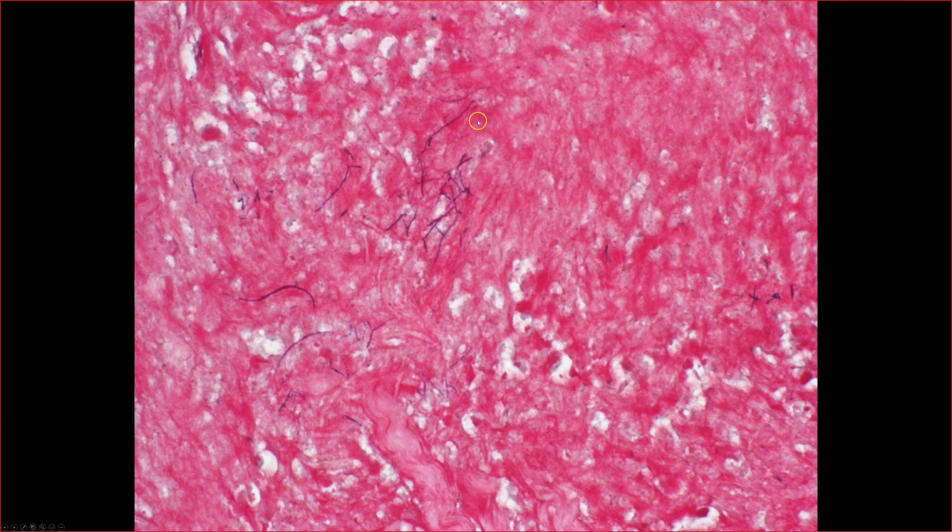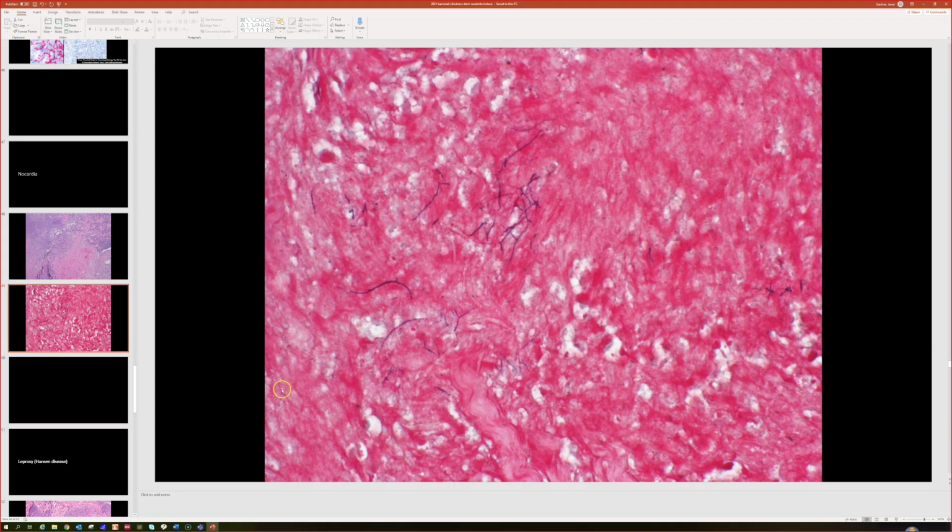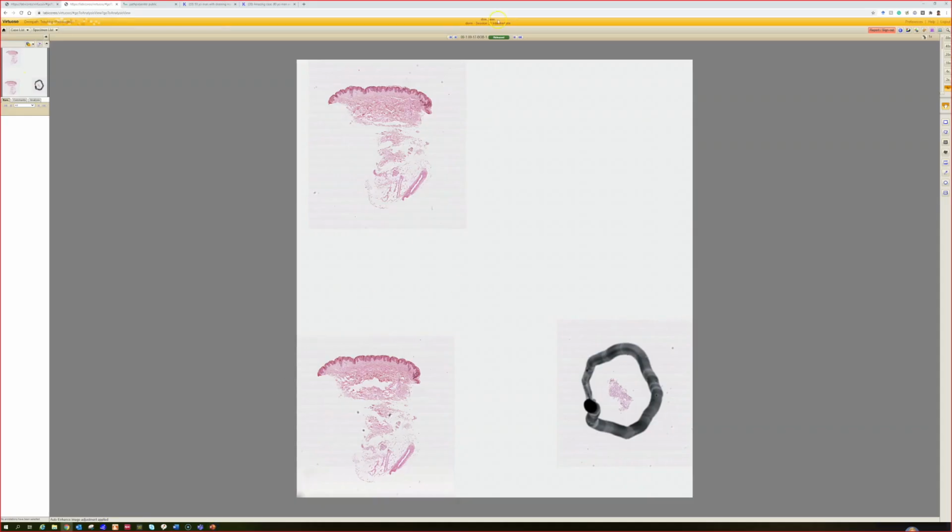And then here, this was the gram stain. Look at these long filamentous gram-positive rods with a kind of almost beaded appearance, I believe, has been described as being one of the features you see. And they can also be weakly acid-fast as well. Although I think I tried that in this case, and it was difficult to work, but culture in this case grew out nocardia. So this is one of the rare times I actually have seen nocardia. And as you can see, there's a lot of organisms, but they're not making the mycetoma sulfur granule, at least not in this case. So that's nocardia.